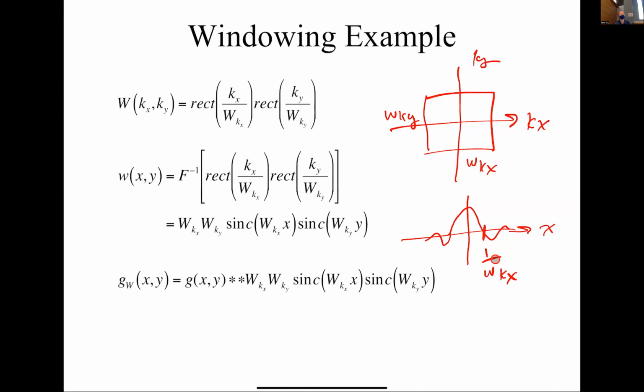So this relates to resolution. The resolution is sort of, how blurry is your image? If you have a low resolution image, then that's pretty blurry. If you have a high resolution image, or one of these super duper HD TVs with super duper resolution, then you can see things in much more detail. So the bottom line is we're going to convolve our object with these sinc functions.